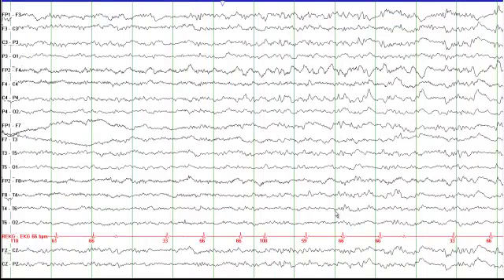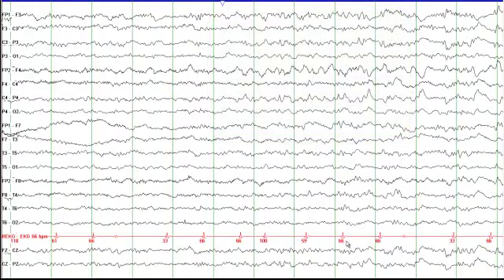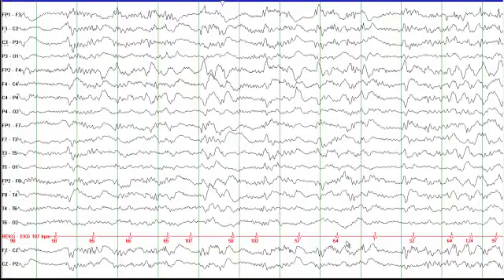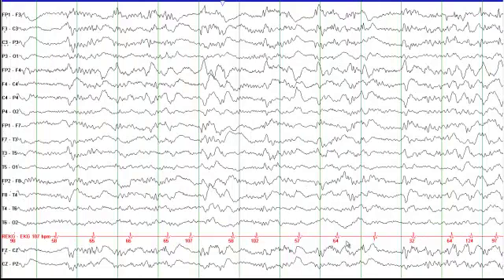On the next page you start seeing some slowing that is more pronounced in the parasagittal electrodes, but it is there diffusely. When you see slowing on the EEG, you determine whether it is physiological — as you would see in sleep — or pathological, as you would see in metabolic encephalopathies or in certain kinds of seizures.